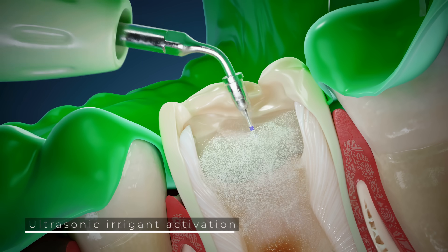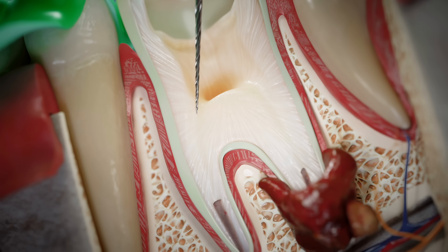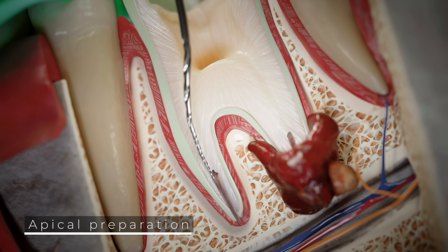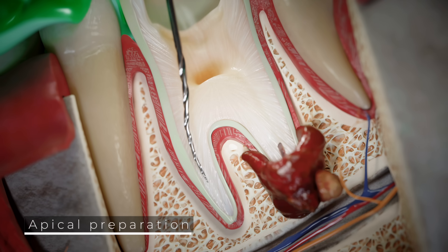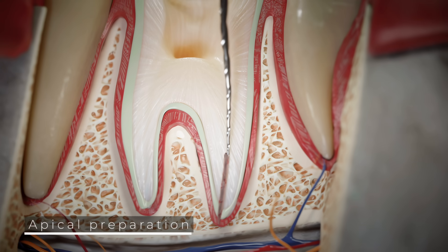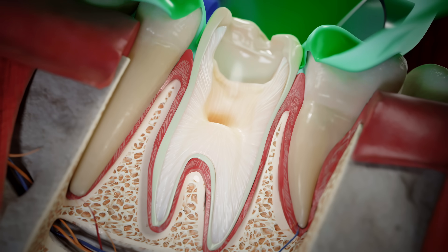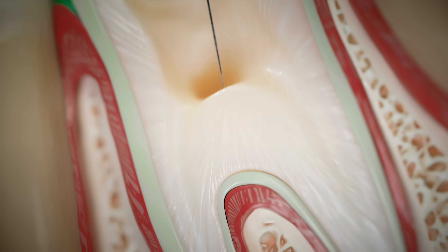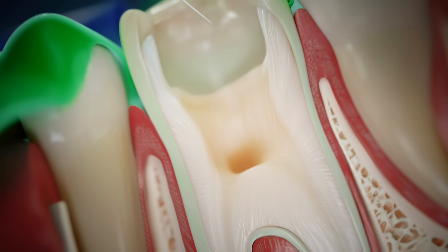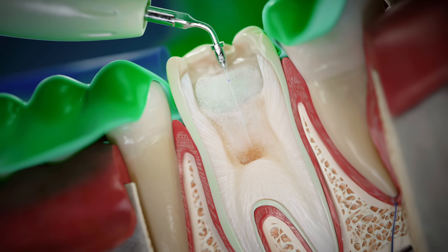To enhance the chemical reaction, irrigant activation is performed. After determining the working length to the root apex, the root canals are shaped by gradually increasing the diameter of the instruments. Special attention is paid to the apical zone to eliminate bacteria from the apical delta and to create an apical stop for the filling material.